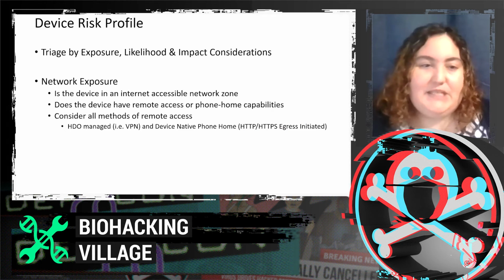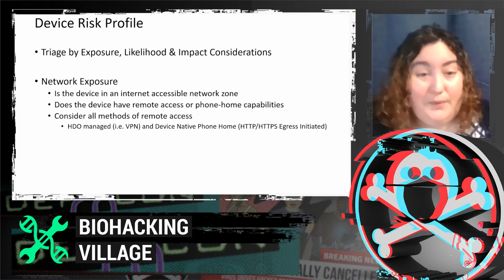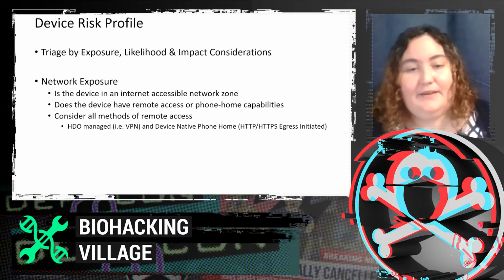So as I was mentioning, the network exposure: is the device in an internet accessible network zone? Does this have dial home capabilities? Is it remote accessible? These all increase your network exposure risk.